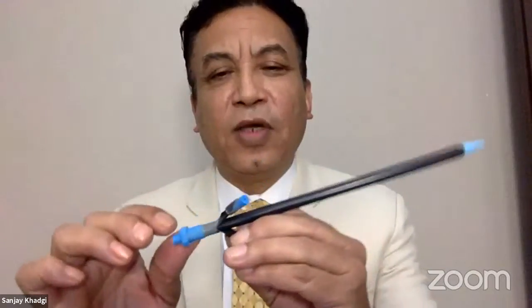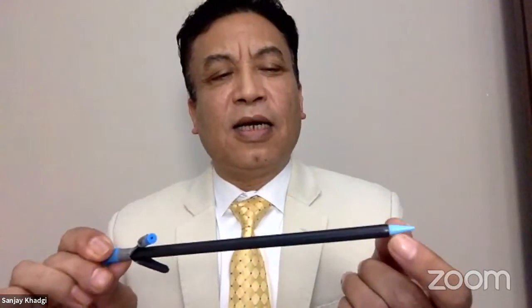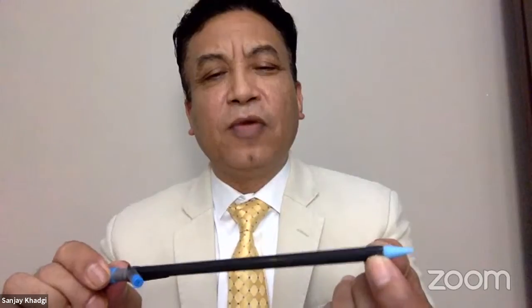You can see this. What I do, once I have done the dilatation, is keep the inner end at the level of the PUJ. Once it is placed, we just peel it away so that the track is short, and then stone evacuation is much faster. So the main aim is to make a shorter track to evacuate the stone much faster. As we don't use forceps and all, we irrigate these stones by means of retrograde saline and the irrigation pump.